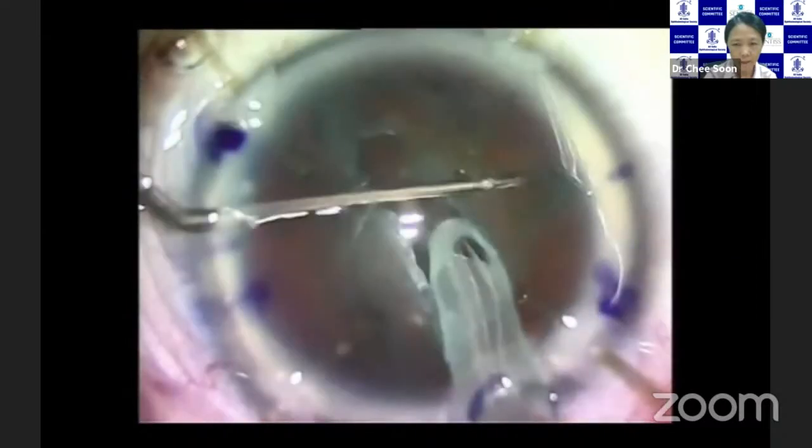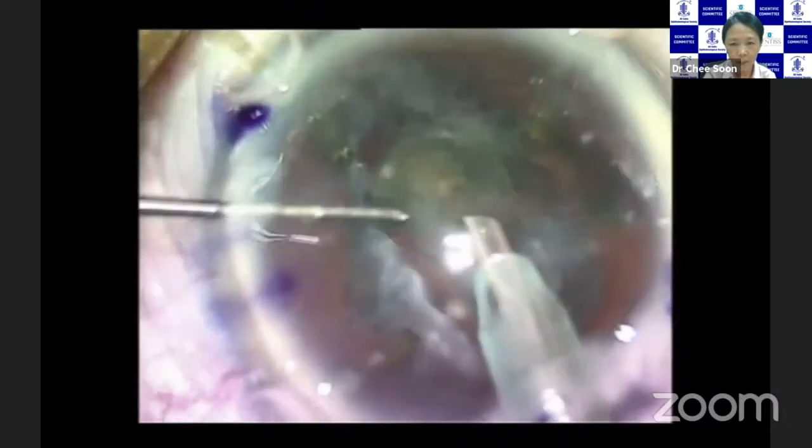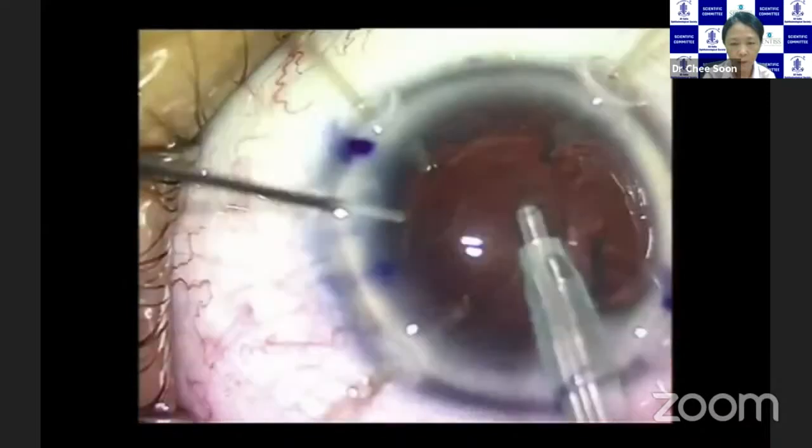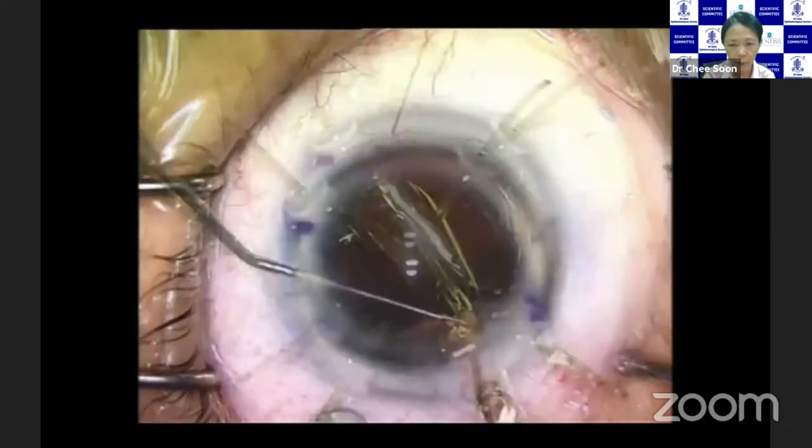So we're doing a stop and chop here, cracking right to the base, and then cross-chopping, so that we don't really have to do any rotation. Tumbling out the first piece, the next piece. You can just tumble all these pieces out. And because the dissection was adequate with the viscoelastic, the CTR does not trap your cortex.